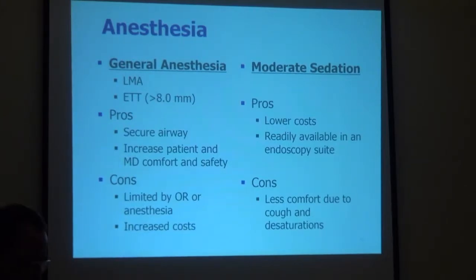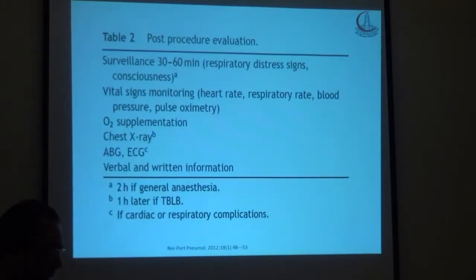طبعا العيان ممكن يبقى ديستيتيوتد، فده الفرق ما بين اللوكال والجنرال. واحنا بنعمل بعد البروسيدير الايفالويشن، بتعمل سيرفيلانس بعد ما العيان بيعمل البروسيدير زي اي برونكوسكوبي، بتبص على العيان لو في خلال اول نص ساعه لساعه في ساينز اوف ريسبيراتوري ستريس، تشوف الفايتال ساينز والكونشسنس وتشوف الاوكسجين. لو كان مديله ميدازولام يفضل ان انت تسيبه على الاقل ساعه بعديها على اوكسجين ثيرابي. لو انت بتاخد بايوبسز وفي مشاكل بتعمل تشست اكس راي، وطبعا بتديله فيربر وريتن انفورميشن.